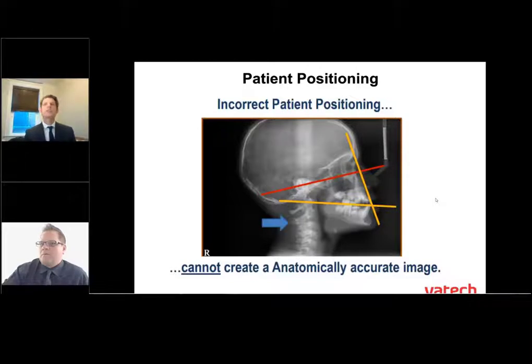So here's our malpositioning. Patient is in the machine with their neck hunched forward, tipped up too high. Look at that nasion bar, Paul. Looks like it's almost on the bridge of the nose here. Yeah, this is definitely an example of what not to do. Malpositioning, you can see the angle here. Also look at the mandible here. You can see the left side and right side. Those should almost be aligned properly if we do have the ear supports tight there.